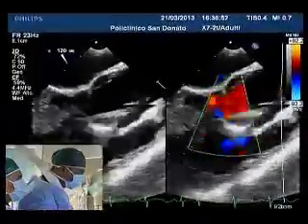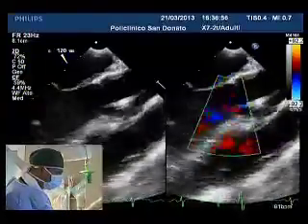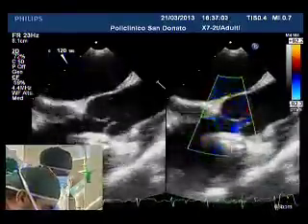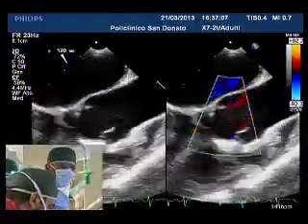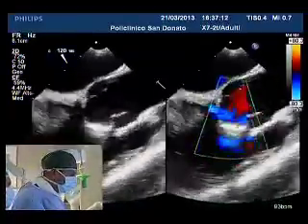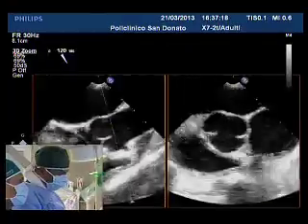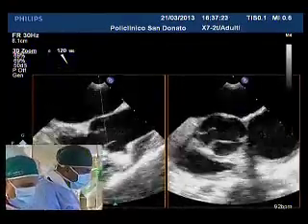But let us be a little bit critical. Yes, please. So I appreciate this device, it's unbelievable. I implanted more than 80 successfully. But we have had 2 patients after 6 months with AV block. So this device is fantastic, it's fantastically designed and it's now fantastically implanted too. But on the other hand, when we consider the results from the past, then we cannot use it again. Or what is your opinion?